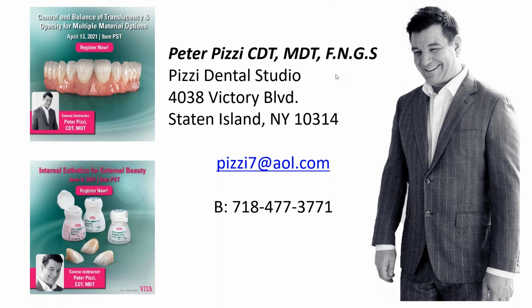I'm using Enamel mixed with about 40% Window. So that's my standard translucent enamel that I use almost on every case. If I want to brighten that up, maybe I minus a little of the Window. If I want to make it a little more translucent, then maybe I add a little more of the Window. So that's my standard skin filter or filtration that I use.